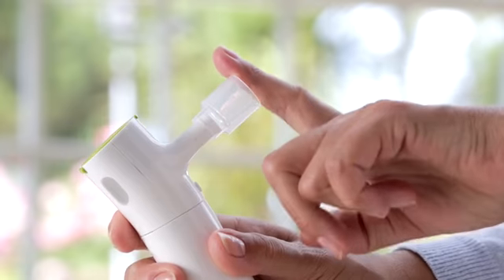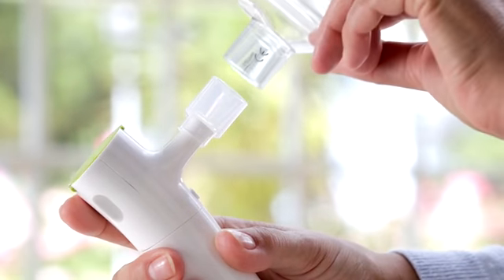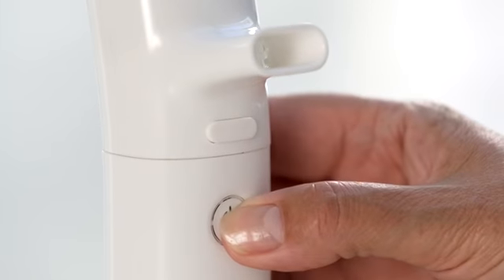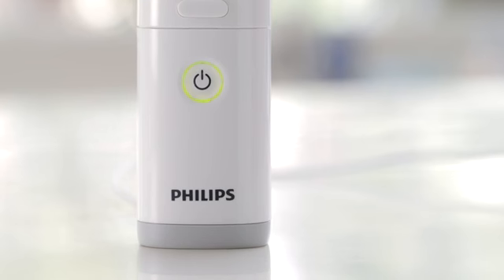If you're using a mask, you should attach the mask adapter to the mouthpiece and then attach your mask to the adapter. Turn on your nebuliser by pressing the on-off button on the handset. If the light is green, the battery is charged and ready to go.